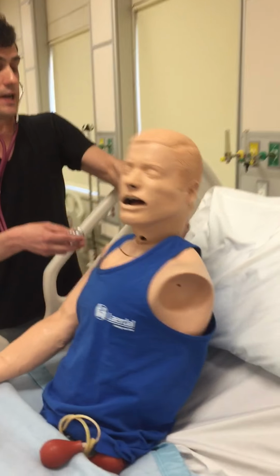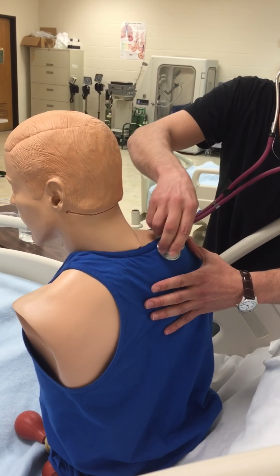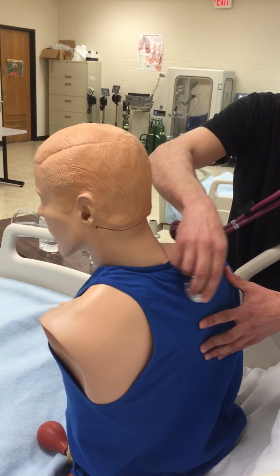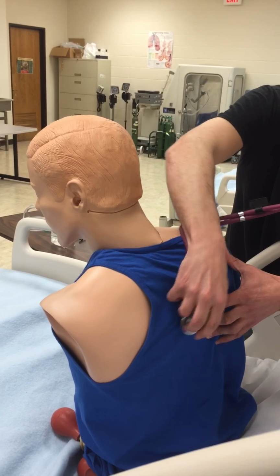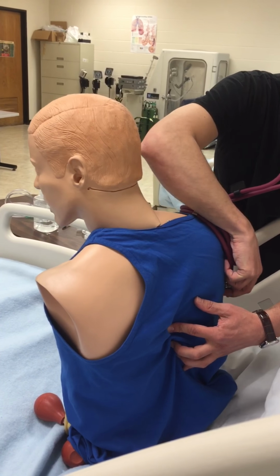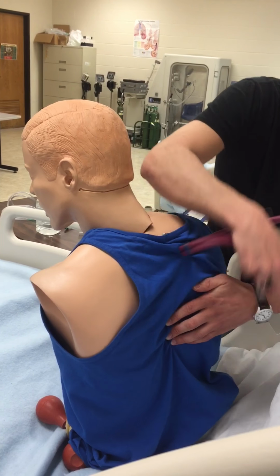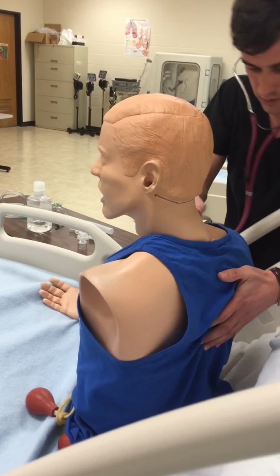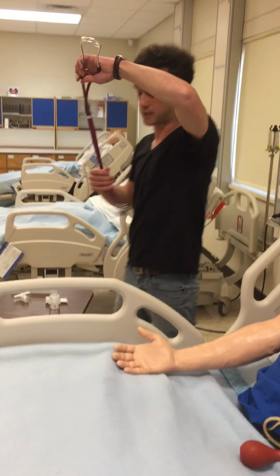And then also on the back. I would then assemble my equipment.